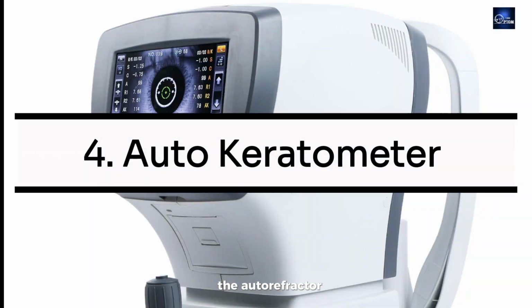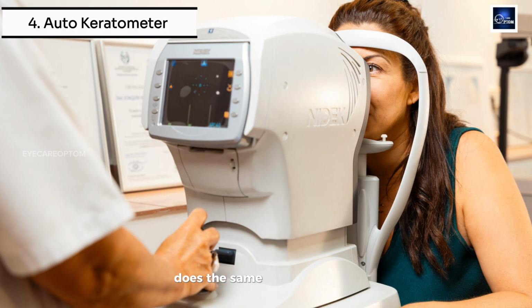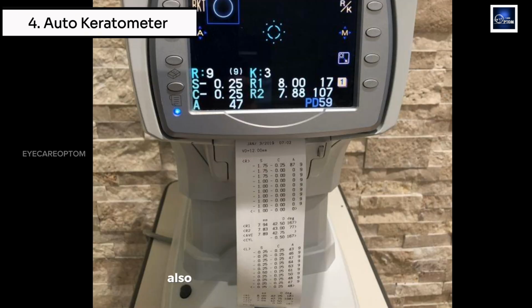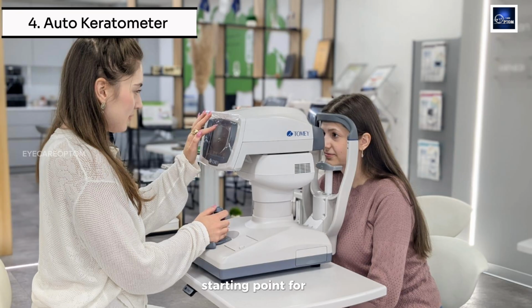The autokeratometer, or the combined autorefractor keratometer, does the same job as a manual keratometer but automatically, with minimal patient cooperation required. It measures the anterior corneal curvature and gives a reading in both radius of curvature and dioptric power along with the axis of astigmatism. This instrument also measures the refractive error of the eye at the same time, making it a fast and efficient starting point for both refraction and contact lens assessment.